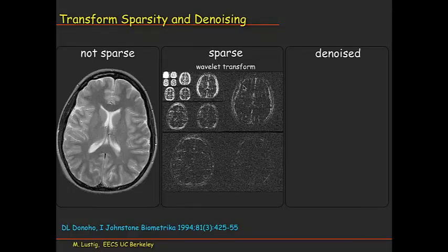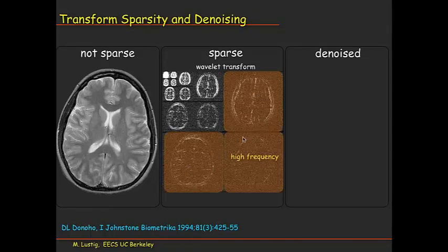And what's a wavelet transform? This is a wavelet transform. This is the magnitude of the coefficients of the wavelet transform of the brain. These represent high frequency information. These represent low frequency information. Then you can sequentially separate them into low and high again and again and again.